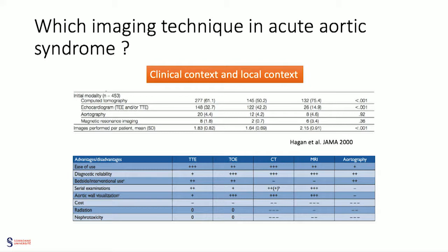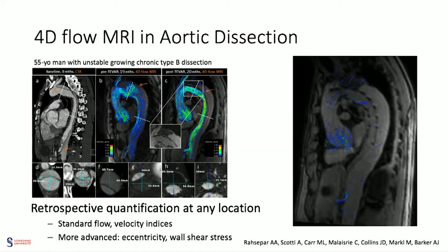I don't know about you in your hospitals. In our hospital, we always go for CT. Those are older statistics now, showing that most centers use CT, of course, in that context. However, in the chronic phase, it can be very interesting.